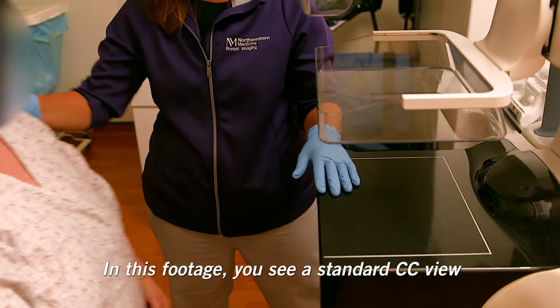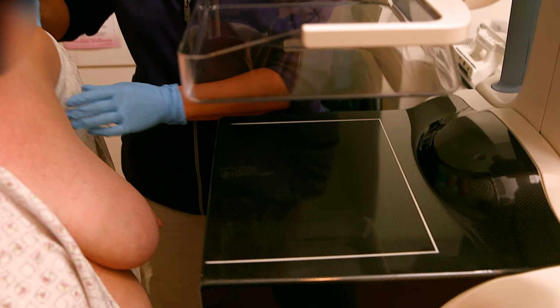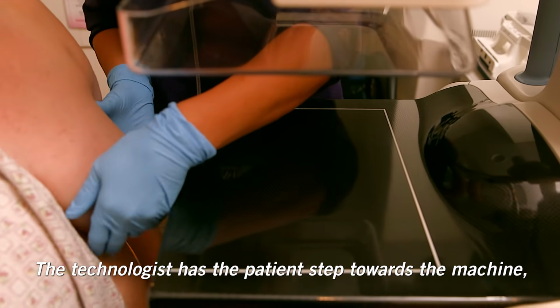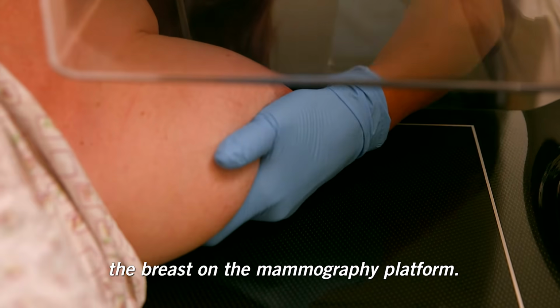In this footage, you see a standard CC view being performed with an anonymous volunteer. In maintaining the patient's privacy as much as possible, the technologist has her patient only open her gown on the side to be imaged. The technologist has the patient step towards the machine, where the technologist then lifts and positions the breast on a mammography platform.